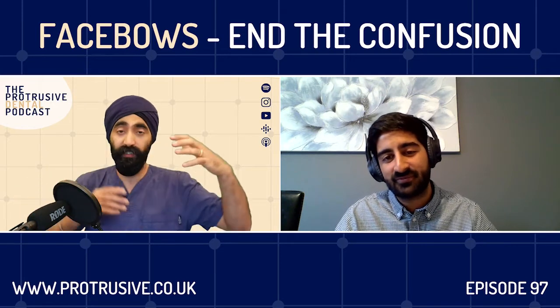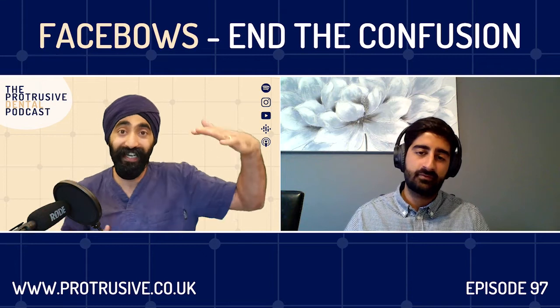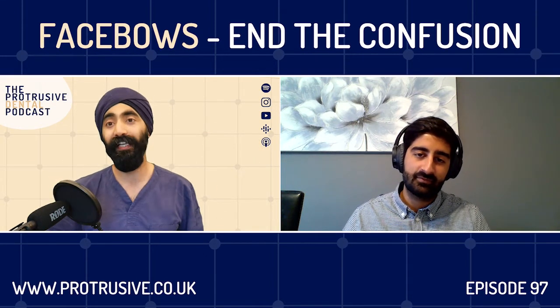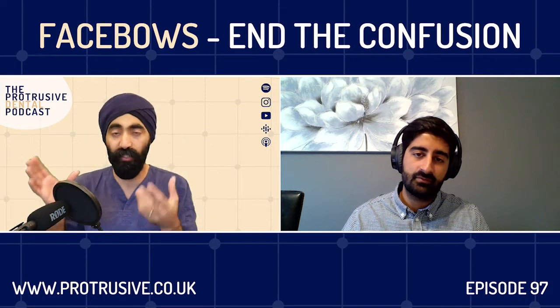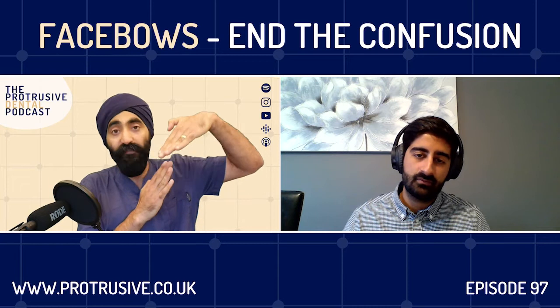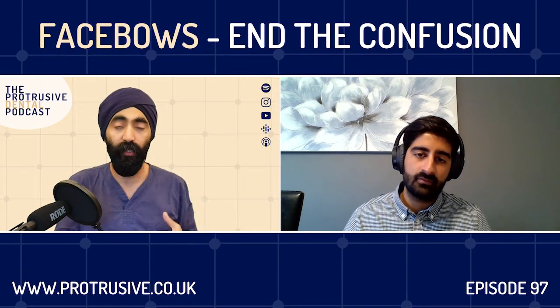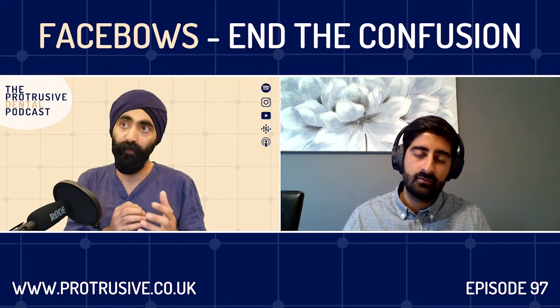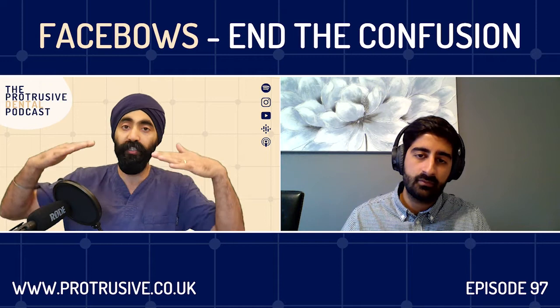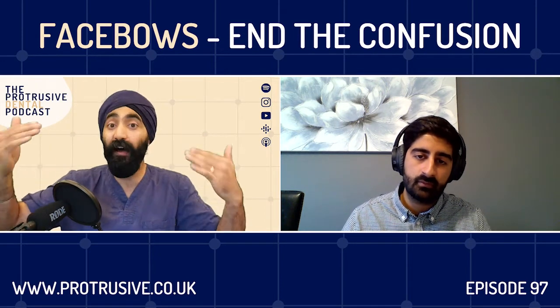The Michigan is an upper Michigan. The lower buccal cusps are hitting against a flat portion of the upper splint, which is much easier to dial in compared to the nuances of cusp to fossa relationship. But you're right, the main key here is if you just give the lab the correct vertical, then you do massively negate the need for that Facebow information, as long as the anterior ramp is steep enough to get some disclusion.